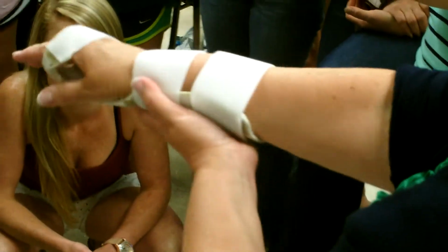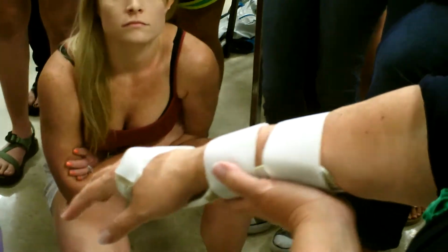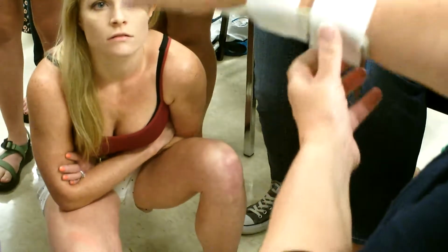We have shearing happening here. So how might we avoid shearing on a splint? What can we do with the strapping to prevent this? What would happen if you made it tighter, though? That's not gonna work because the splint is rigid.